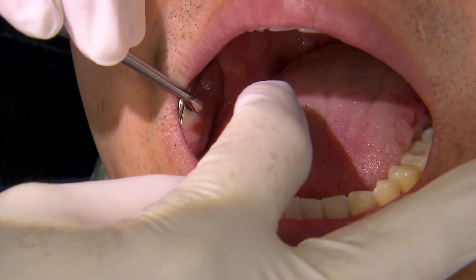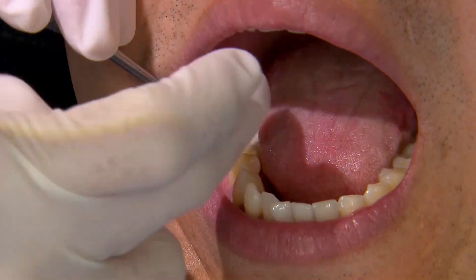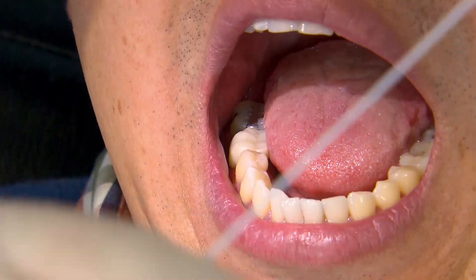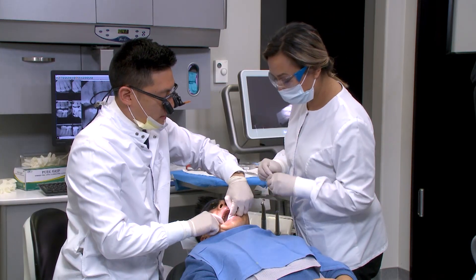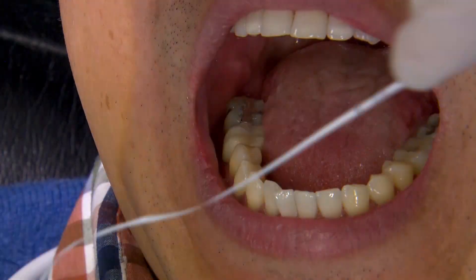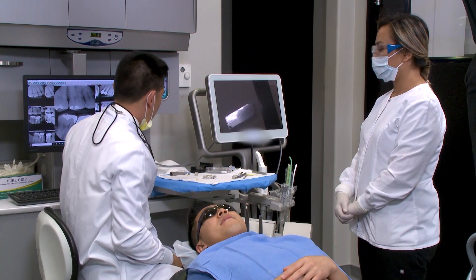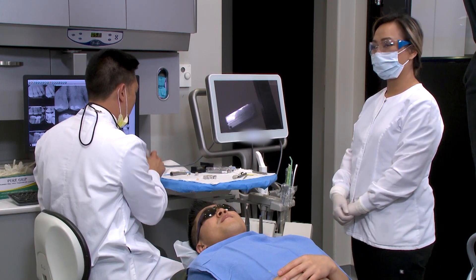We're going to go ahead and seat this down. Normally for interproximal contacts I like to use a shim stock — a very thin piece — to make sure it doesn't tear. But here we're just going to check it with floss. We certainly do want to have contact. This is probably the most universally used method to check contacts.